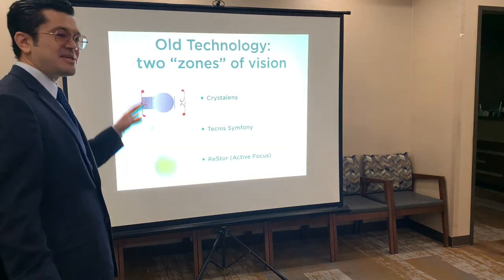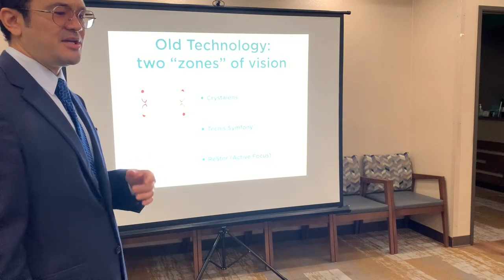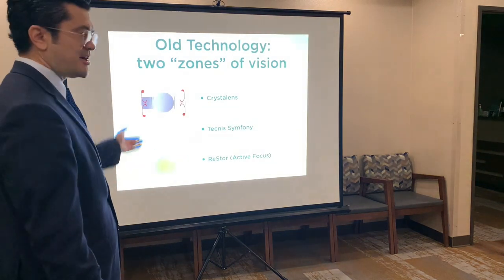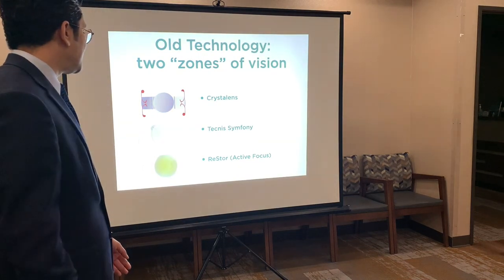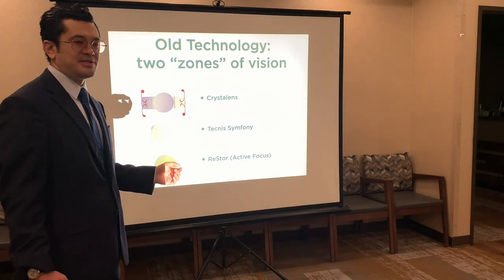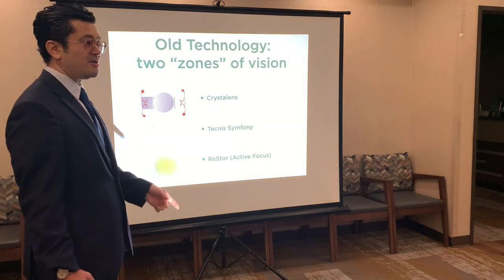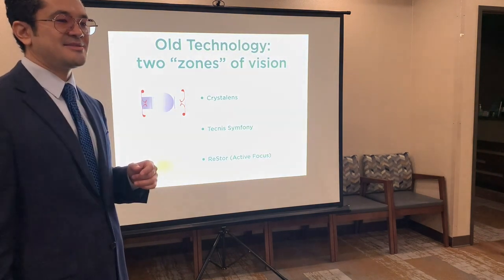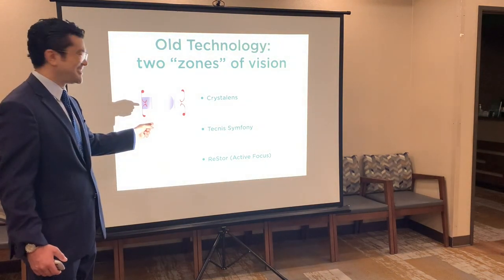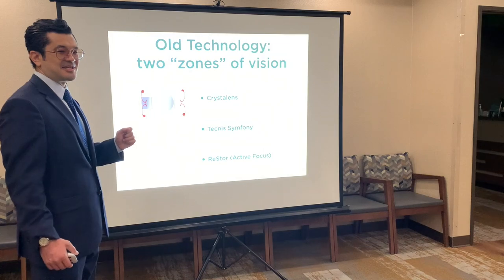So nice to have an idea about some of the history. Occasionally you'll run across patients who had surgery 10 years ago and they'll tell you about these lenses. And notice, interesting, you can kind of look and a lot of times tell by the shape of the lens. You can look at them and you can say, oh, I can see you had a crystal lens. And they'll say, how did you know? And we can tell, only one lens looks like this. I mean, it's pretty significant.